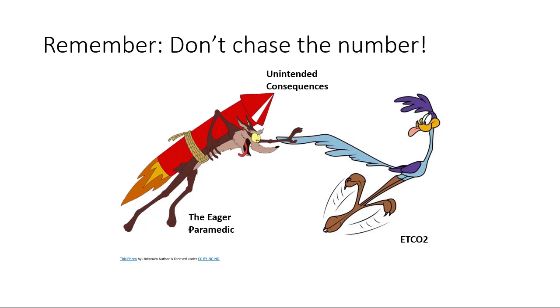Even dropping the end-tidal CO2, and there have been studies on this, between 35 and 45 is normal. Dropping it below 30 with hyperventilation, somebody bagging the heck out of them and dropping it down to 29 or 25, significantly increases brain injury and also significantly decreases neurological outcomes.